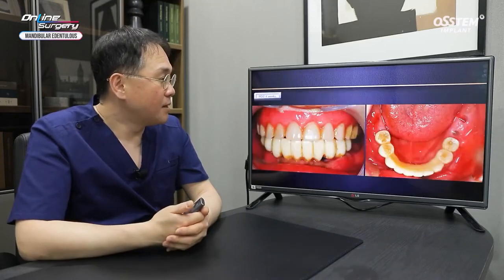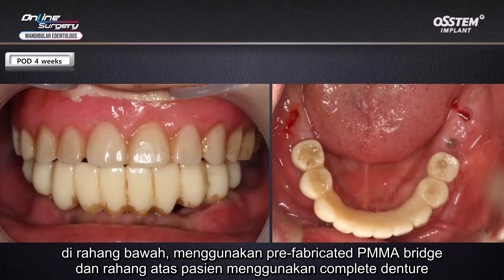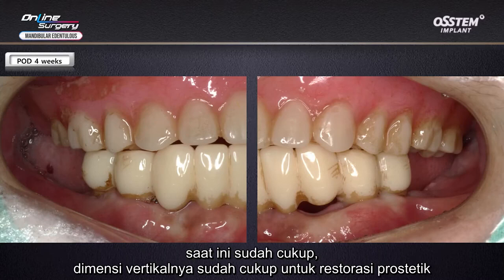This is the follow-up image at 4 weeks. In the lower, the patient is using a prefabricated PMMA bridge, and in the upper, the patient is using a complete denture as temporary restoration. Pre-op, if you look at lower right, the vertical dimension is very lacking. Grinding has been done sufficiently. VD looks sufficient for prosthetic restoration.